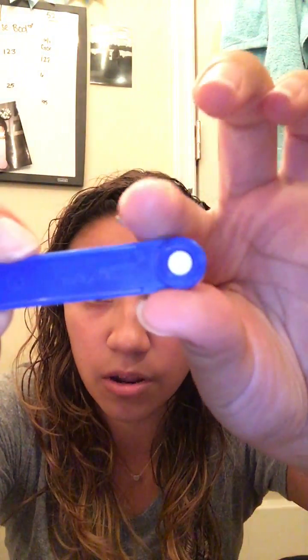So I kind of break out a mirror, and then sometimes I'll use my phone flashlight, but you'll kind of look up and find the hole. You just put that loopy part into the hole there, and then you'll push it back. So I guess I can expand mine since I hopefully get it out tomorrow. When you push it back, it started from here, and it should go back that way and kind of stop there.